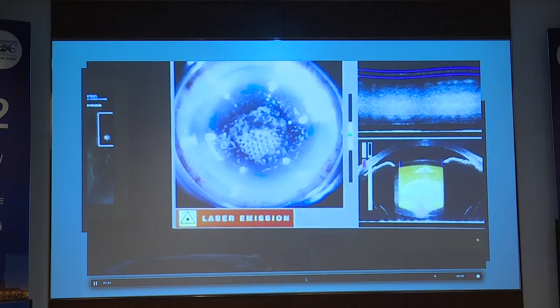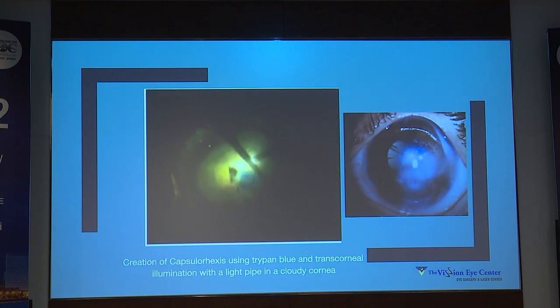And you have a little more respect for the iris at that point in time. Now, if you have a corneal opacity, you can use retro-illumination or side illumination, which can help you judge with trypan blue staining of the anterior capsule. Look at the opacity from the side chandelier that you can have. The important thing, again I repeat, at any given point, for any opacity, for any good cataract surgery, is a great rhexis, no question about it.